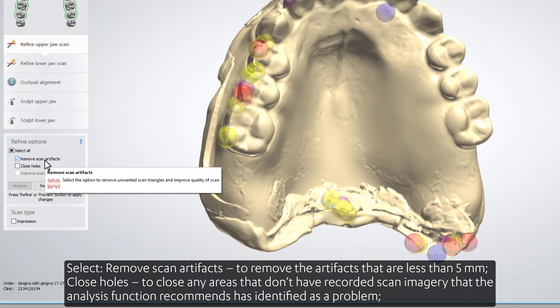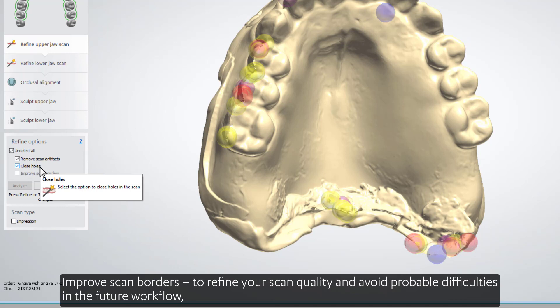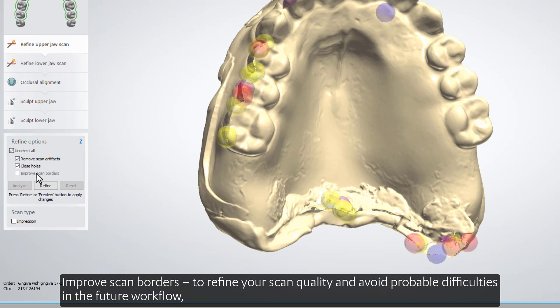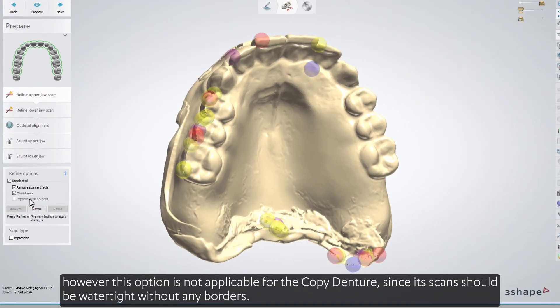Close Holes closes any areas that don't have recorded scan imagery that the analysis functions have identified as a problem. Improve Scan Borders refines your scan quality and avoids probable difficulties in the future workflow. However, this option is not applicable for the copy denture, since its scans should be watertight without any borders.